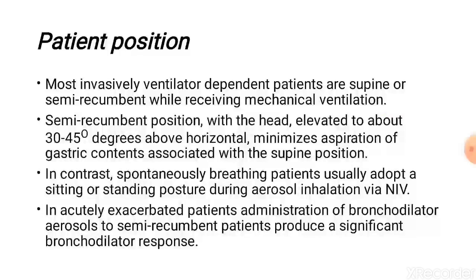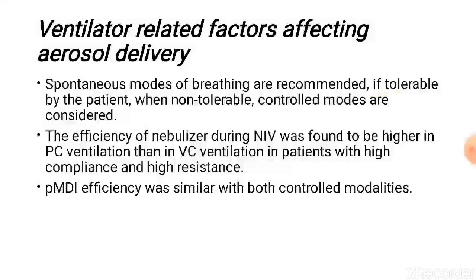Patient position: simply try to put the patient in a 30 or 45 degree sitting position when delivering aerosol, because delivering aerosol when the patient is lying down in the bed is not very good. Besides, the patient might ingest some of the delivered aerosol.